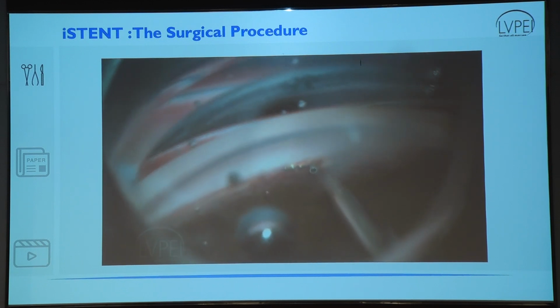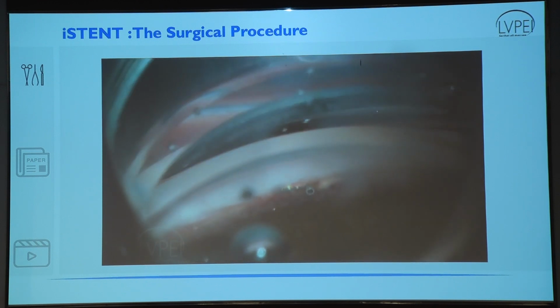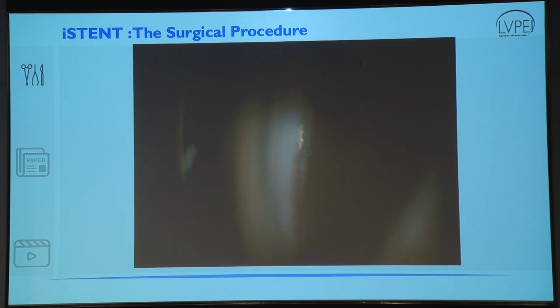This is typically performed along with phacoemulsification after the surgery is over. So it gives you a very good access to the trabecular meshwork and reduces the problems that you could have with the bleed affecting the phacoemulsification later.